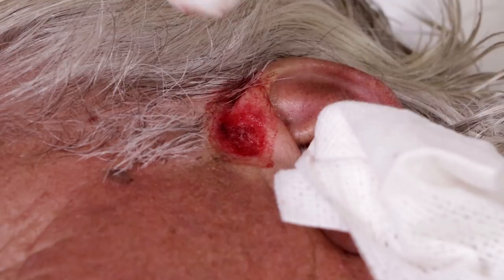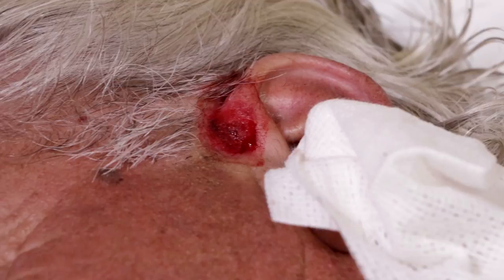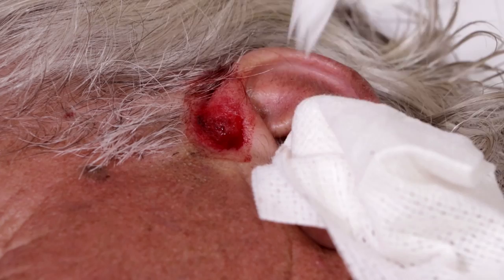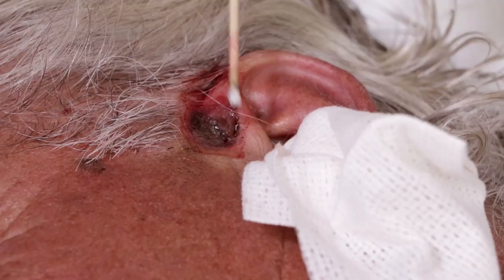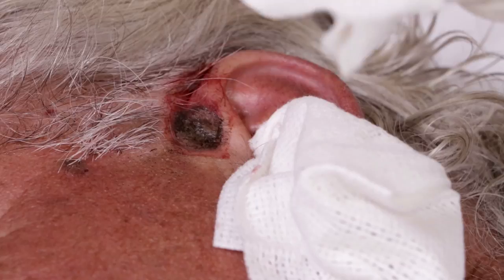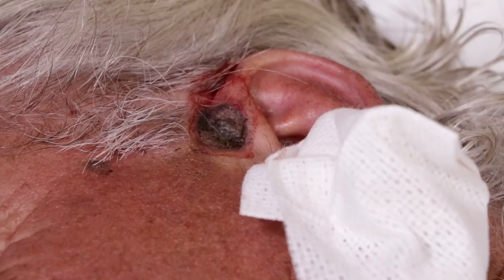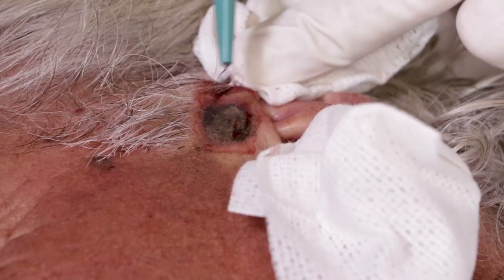Alright, we're going to do the cautery again. It's pretty much right on the surface — very superficial, partial thickness as they call it. Alright, number three. Same place — third and final pass with the curette.